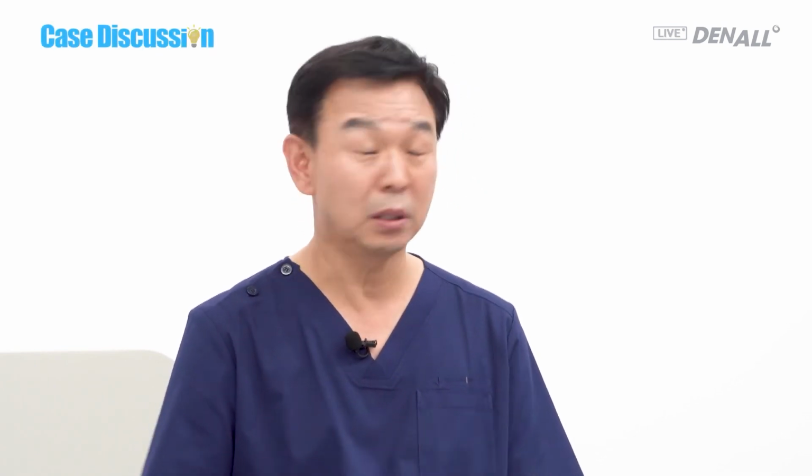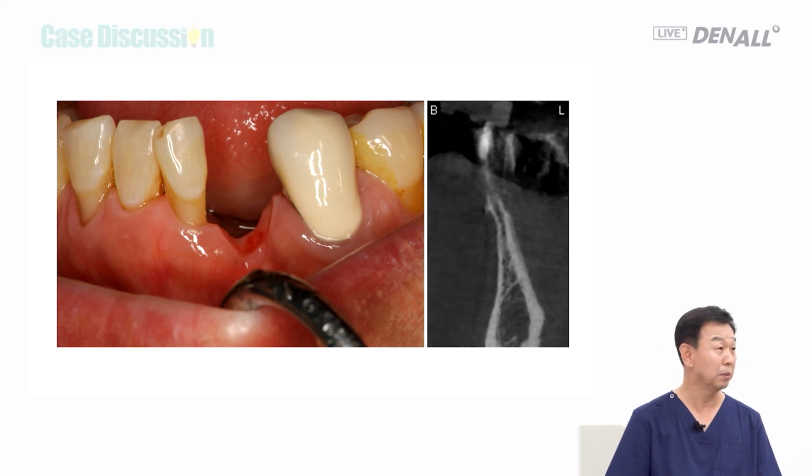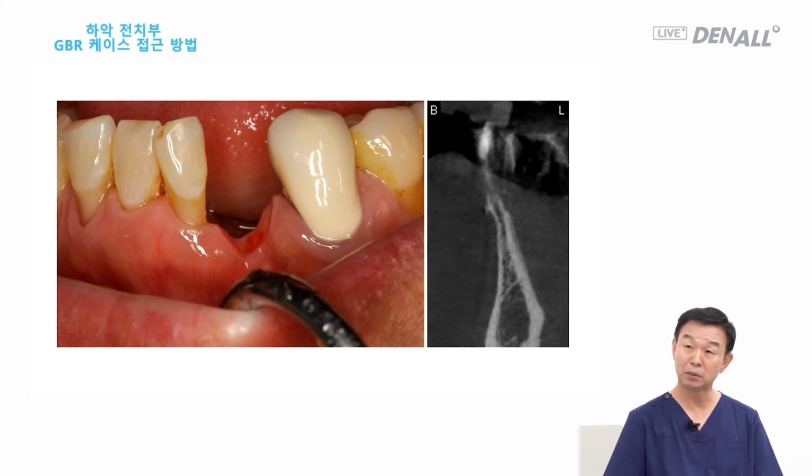But if you are skilled at using it, I sometimes use 2.0 implants out of occlusion. In the long run, compared to thick implants, the cervical area shape can be better. That's the advantage. In this patient, it's a very sharp knife edge. 2.0 wouldn't work either. So GBR is required before placing MS implants or 3.0 two-piece implants. That's my view. Thank you very much.